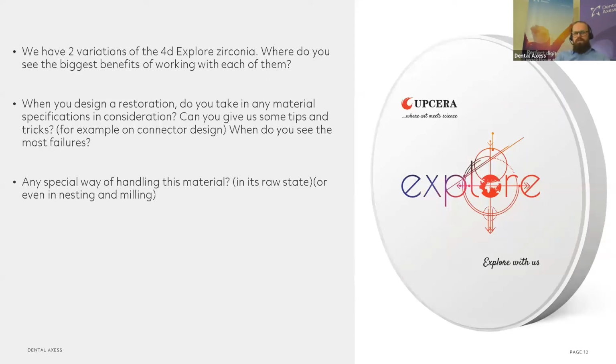Yeah, and it's a very obvious difference, and it's something that I encourage everybody to do and to try: sandblast the surface, do the sintering, have a look at it. It's amazing the amount of surface you can create by doing that.